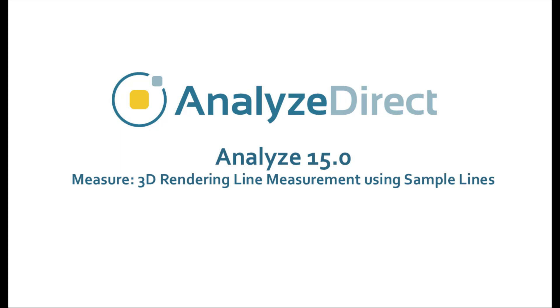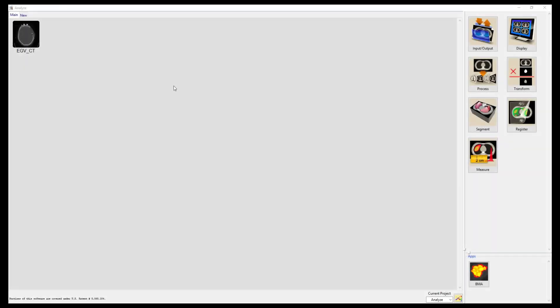The Sample Lines tool in Analyze can be used to make measurements on a 3D rendering. In this video we will make Endpoint and Surface Distance measurements on a CT head dataset.